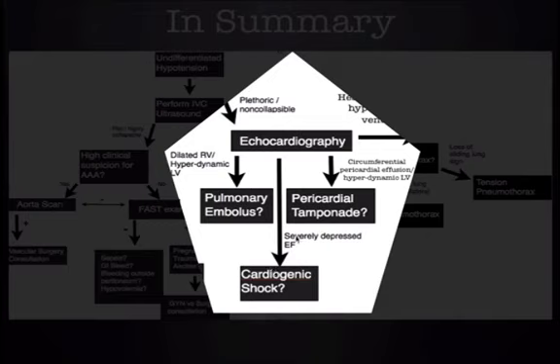vasopressors. If there's a circumferential pericardial effusion with a hyperdynamic LV, in addition to a plethoric non-collapsible IVC, then you assume pericardial tamponade. You go ahead and pull the pericardiocentesis tray to the bedside and go ahead and mobilize consultation versus transport to a facility that can provide pericardiocentesis.